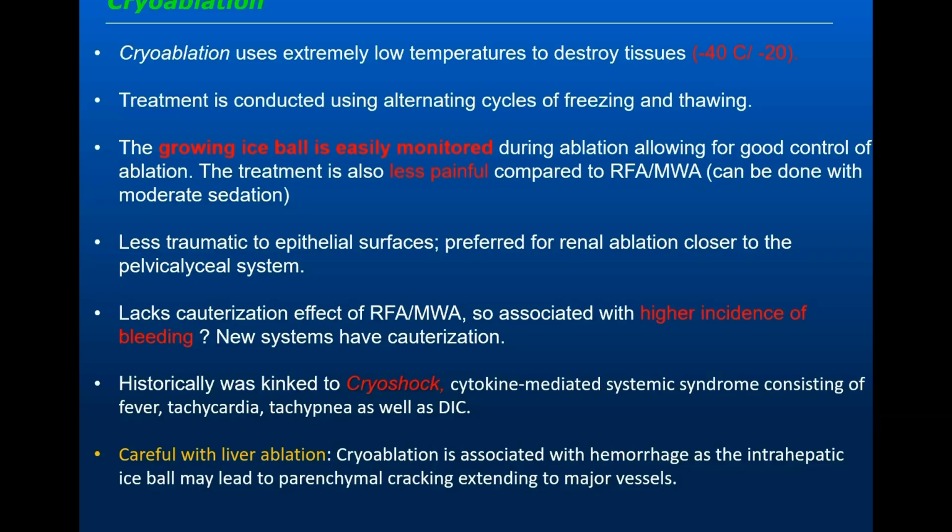If you use this probe, you will get 3 centimeters, stuff like that. But you really cannot see it. Even when you do ultrasound and you see the echogenic cloud that we talked about, it is known that it exaggerates a little bit what's going on. But with cryoablation, you can see the ice ball very well. So you can be 100% sure that you are covering your tumor. And I will show you this in the next slide.